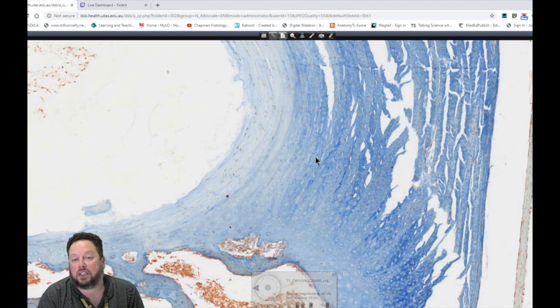Okay, well, I think that pretty much covers the histology of cartilage. Unless anyone has any questions on the chat there, we can begin our look at the histology of bone.